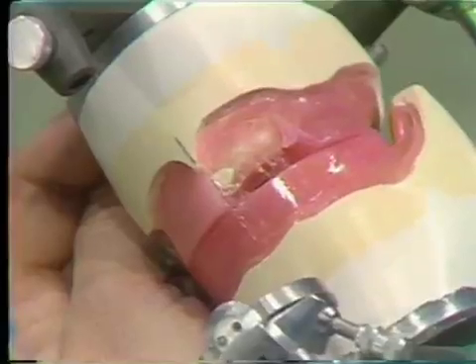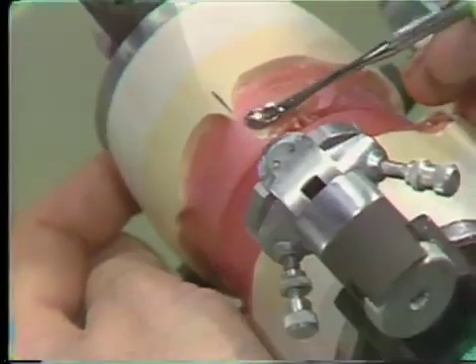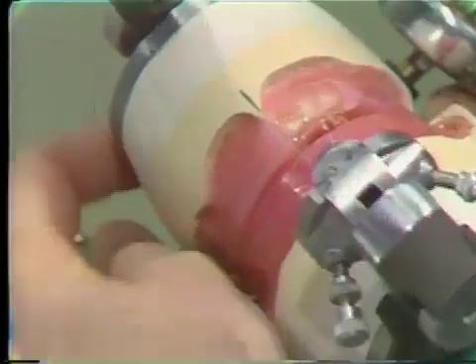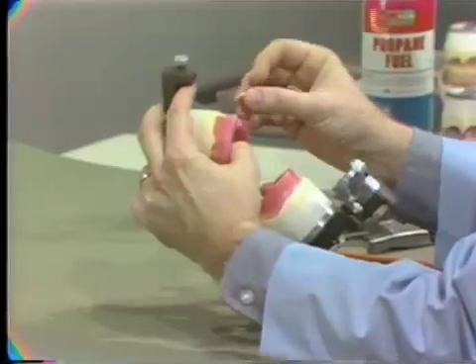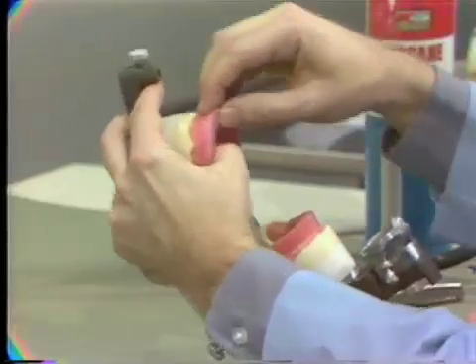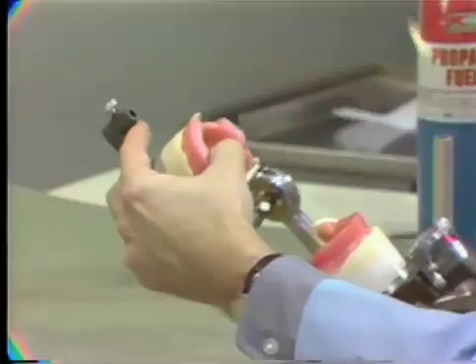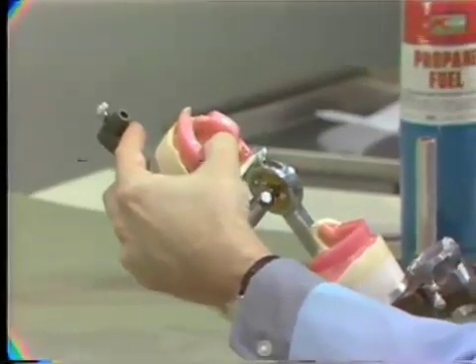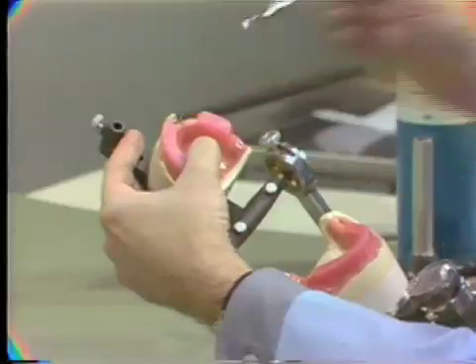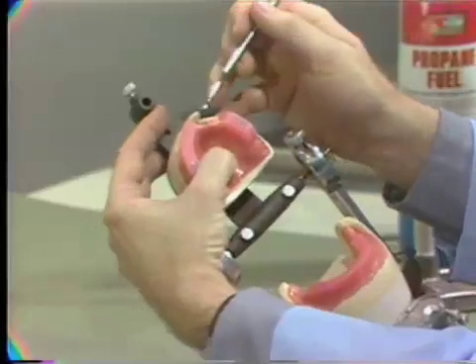Now the first step in placing the tooth, of course, is we have to make it fast in some way, so we'll just add a little bit of molten wax in this area, and then make the initial attempt with the tooth. Now, as we've discussed in the lecture and as written in your handout, the requirements for the central incisor are that the incisal edge will be 1 millimeter below the plane of occlusion. So the first setting is just that, it's the first setting, and I'm sure I'll have to make some adjustments, but just to see if we're in the ballpark here or not, I'm going to make an initial setting of the tooth and then look at the symmetry from all angles and determine what the next step should be.